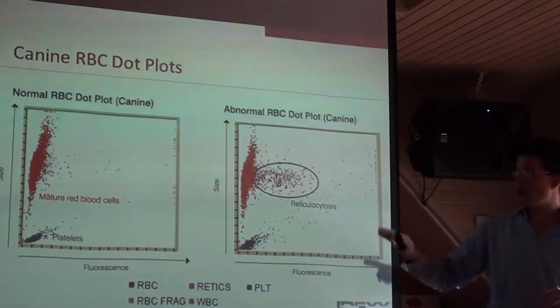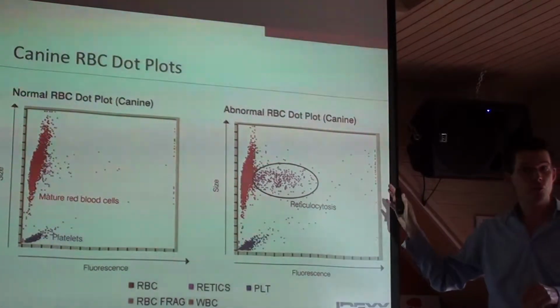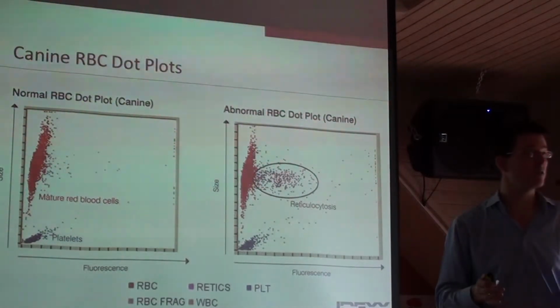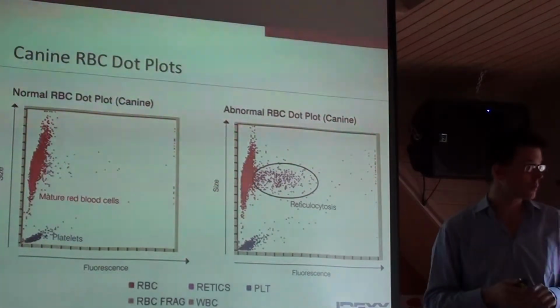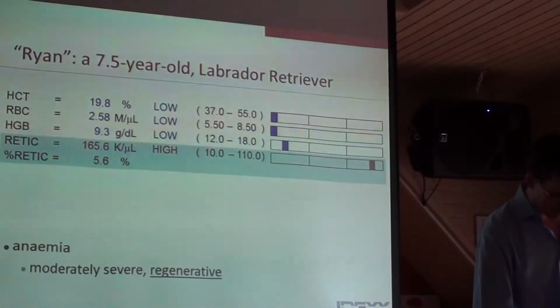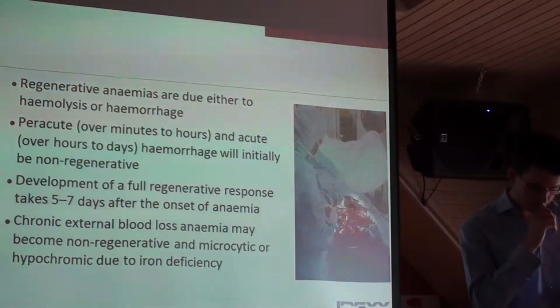Whichever analyzer you have, it will have some form of graphical output. It only takes a few seconds to look at it, and you will get a lot of useful information that goes beyond the numbers on your report.